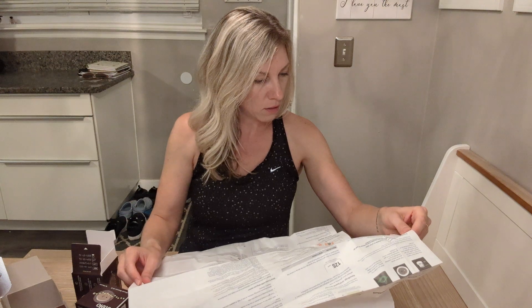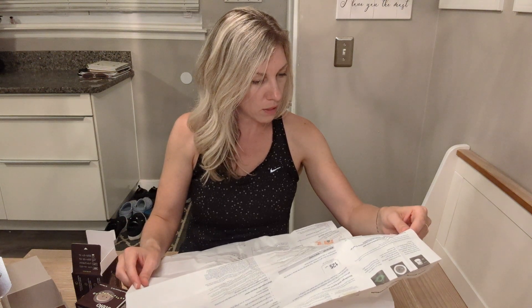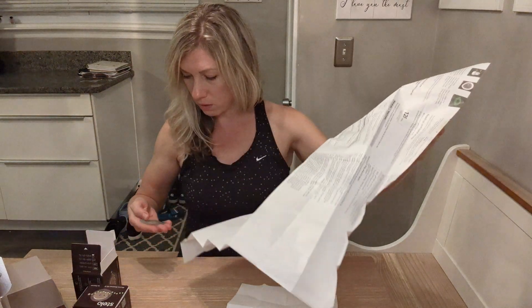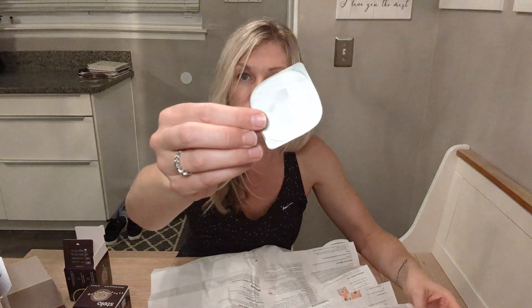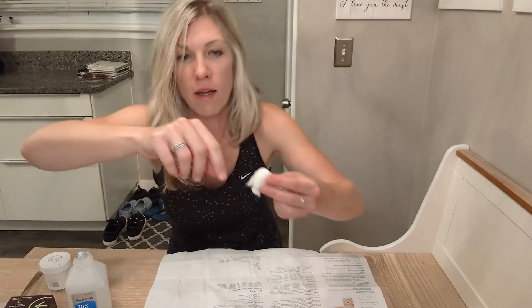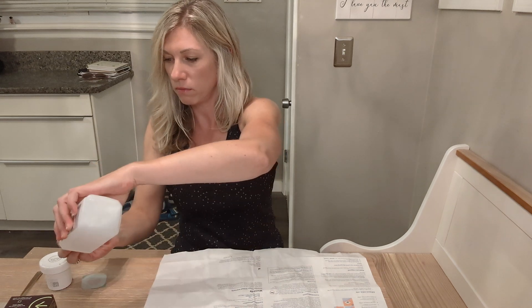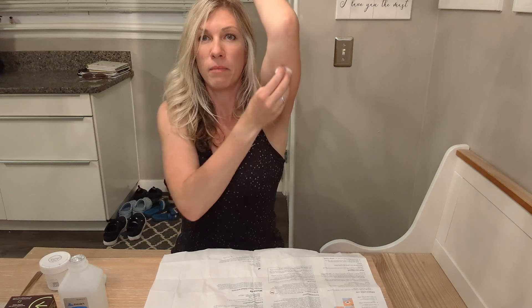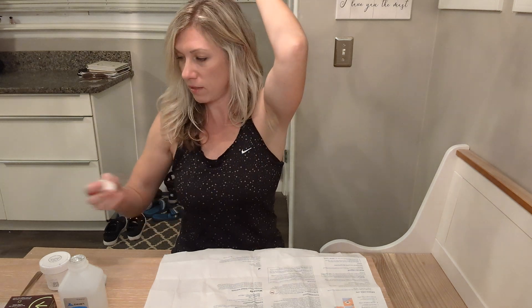Clean and dry the site. I already did that with soap and water. Then rub the site with an alcohol wipe to get rid of oil. I had to pause the video to grab my alcohol swab — you'll need to make sure you have some rubbing alcohol when you get your Stello by Dexcom CGM. That is drying now.